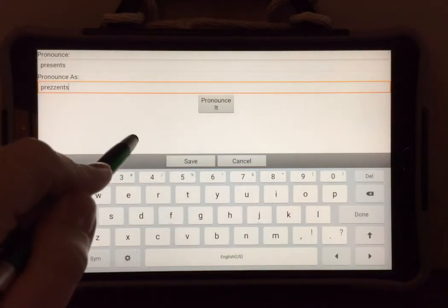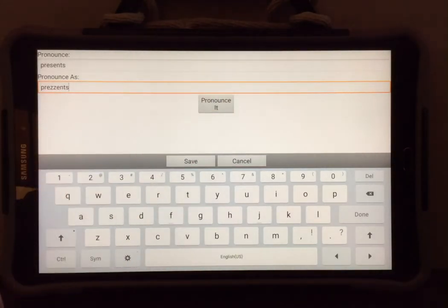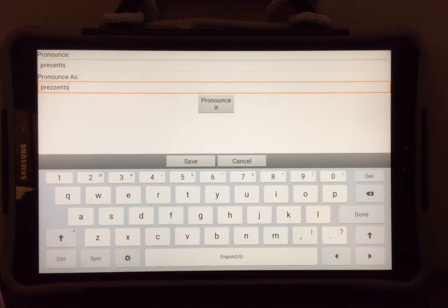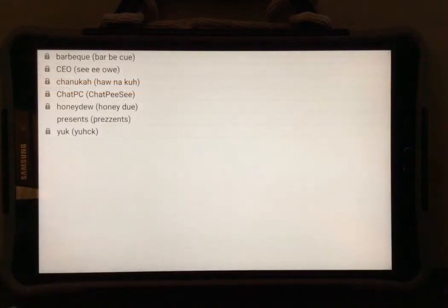Once you have the pronunciation the way you would like it, you can select save.